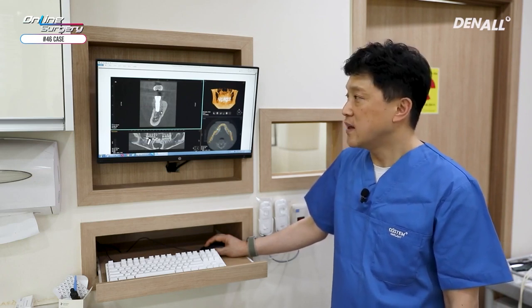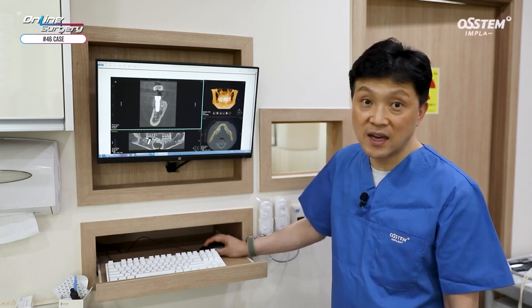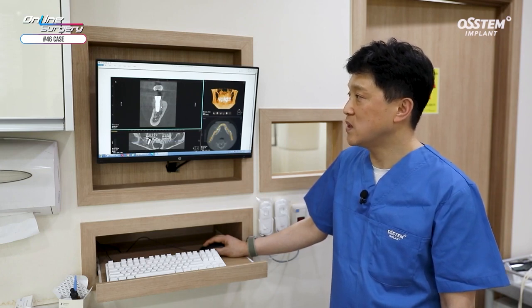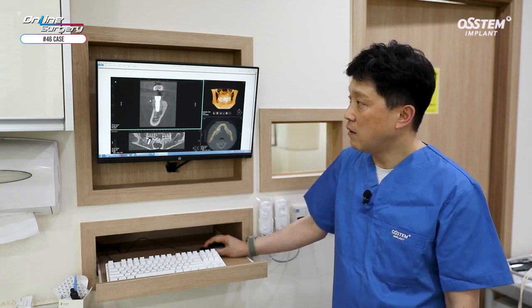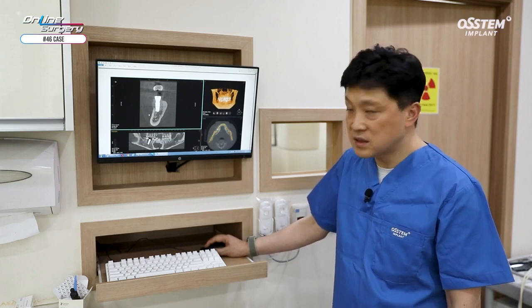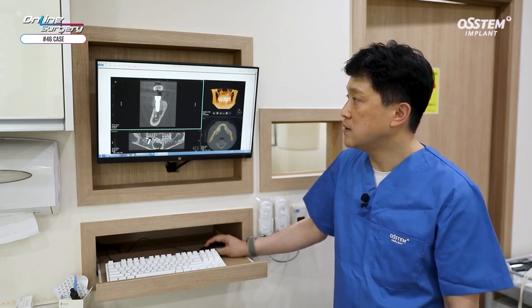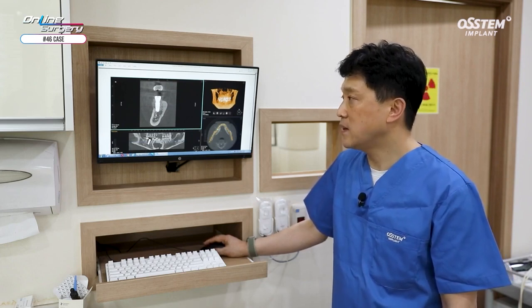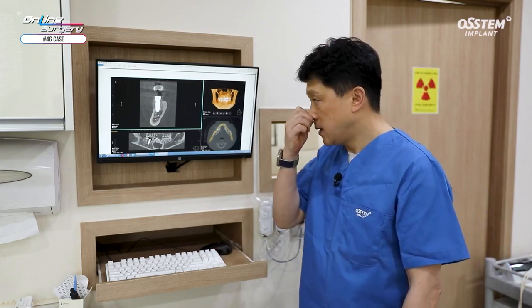In these cases, you need to place implant significantly lingually to get the ideal implant placement position. More so than the desired position, it has been placed more buccally, but membrane stabilization was done as well as internal and external socket graft. Hence, I think it will not affect the long-term stability of the implant nor the prosthodontic steps. Significant bone regeneration was required for this patient, so prosthesis will be delivered post-op 16 weeks.